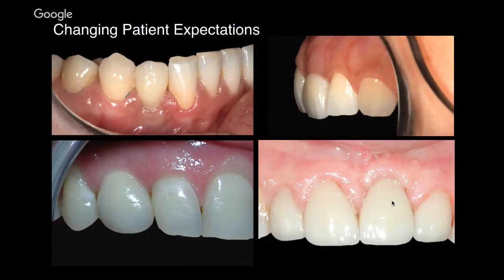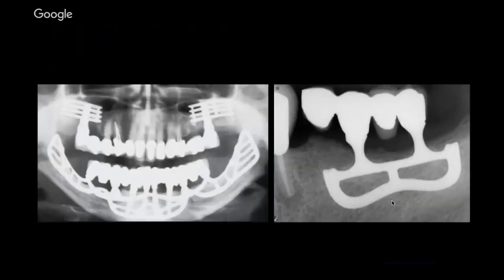Let's start. In modern implantology, implant and abutment connection is the most important key to long-term success and especially aesthetic success. Correct understanding and proper application of these helps to prevent biological and mechanical complications. The years when modern implantology started to gain momentum in our country are 1995 and beyond. The treatment options we offered to patients before were blade or knife and subperiosteal implants.